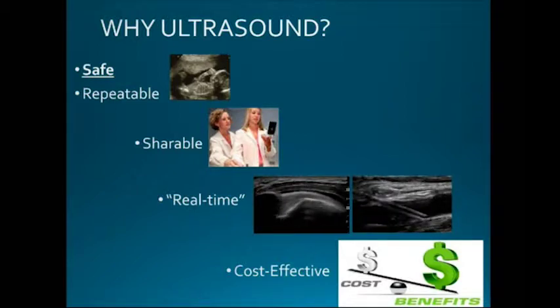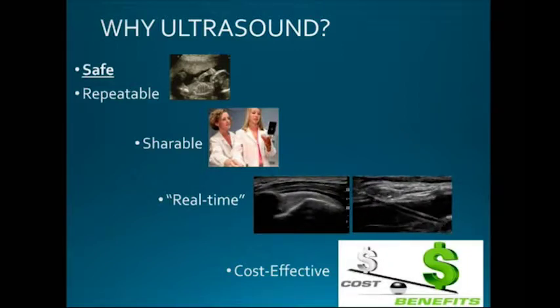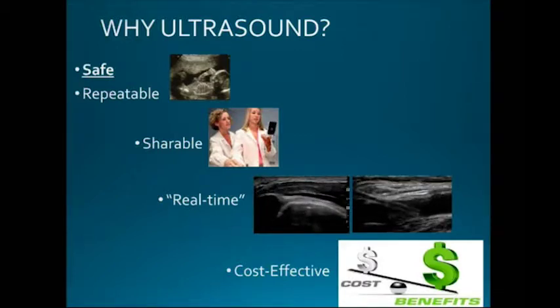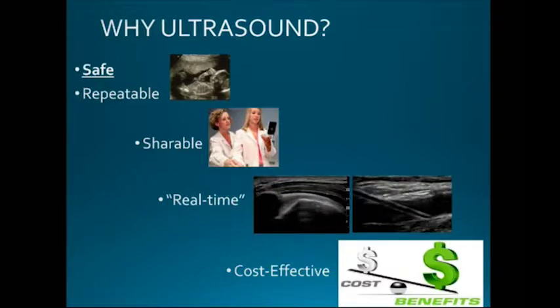What I really like, as somebody who teaches physical exam, is that unlike looking in the back of the eye, or having somebody else feel for, say, the splenic tip or the liver edge, which is highly subjective and I can't share in that experience with the learner, ultrasound is very shareable. Very often some of my med students will be looking in the back of the eye and I'll say, oh yeah, I see the disc, I see the disc. But with ultrasound, when we're ultrasounding the back of the eye, they can't fake that they see it. I can see what they see, right? So it's really helpful from a teacher-learner relationship because we can all share the same experience.